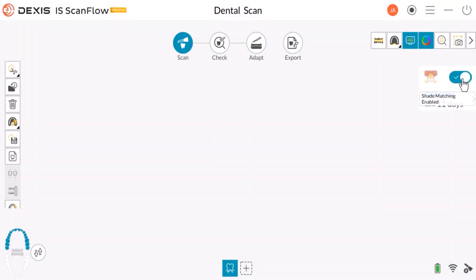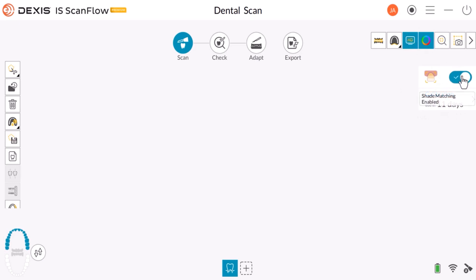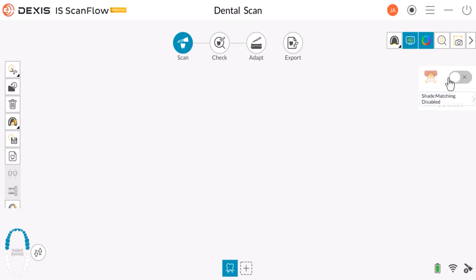When you open the DEXIS IS ScanFlow acquisition window, the shade matching feature is enabled by default. If you wish to change that, click here to disable shade matching. Note, if you save the scan with shade matching disabled, the software will remember that it was not enabled. Click to enable it if you wish to use it.